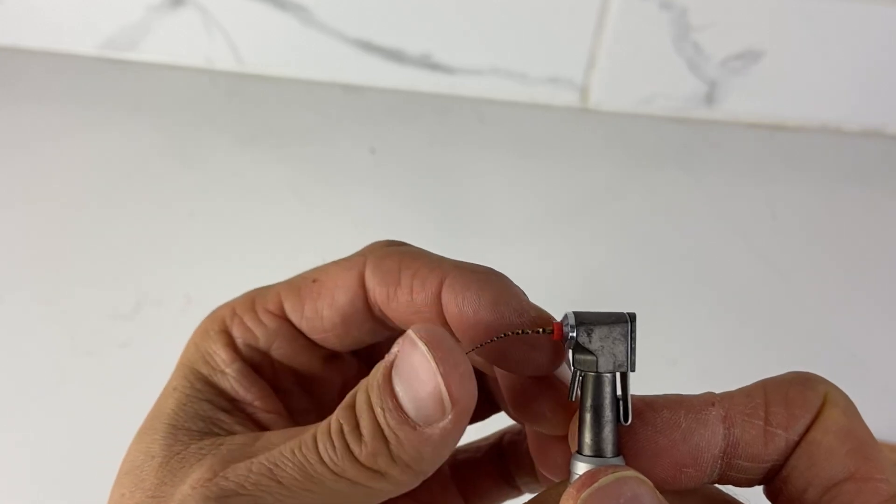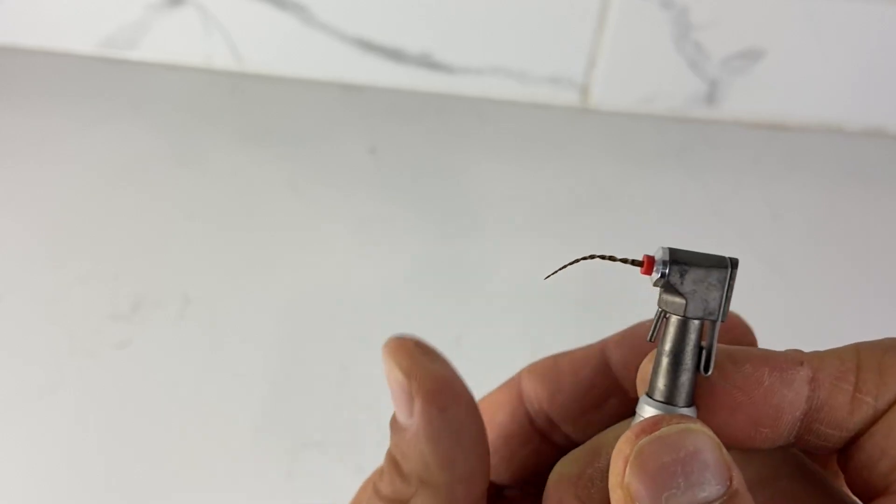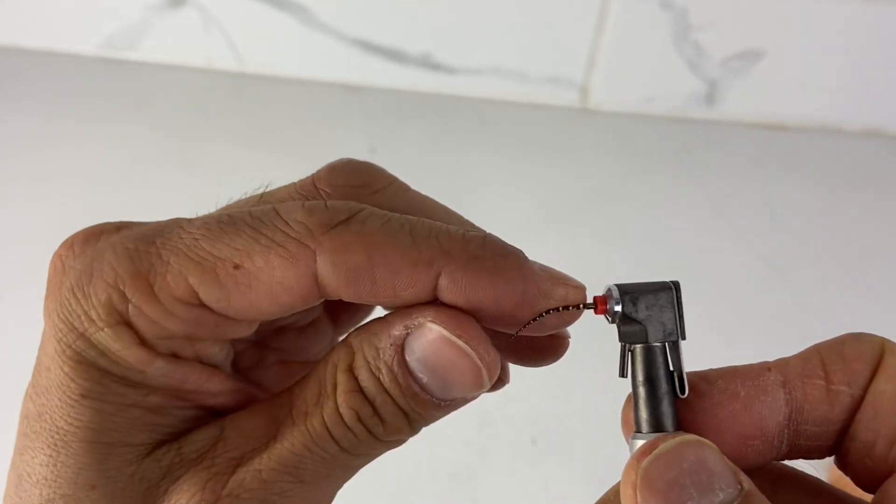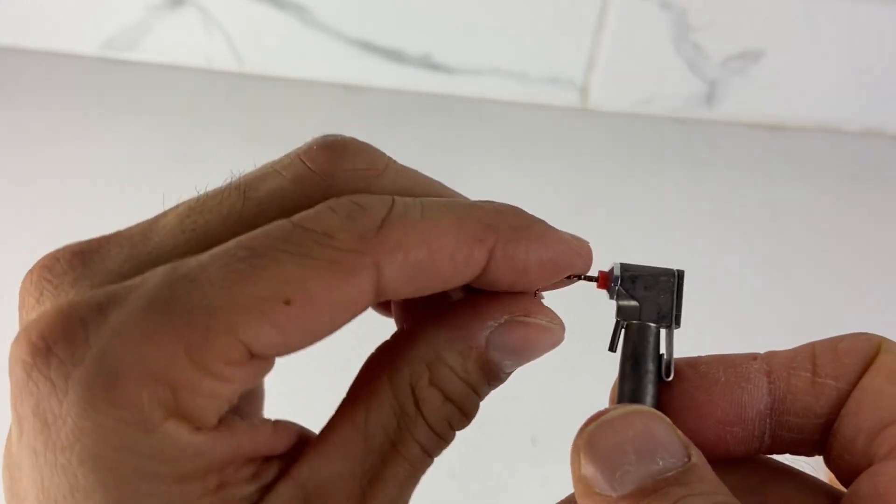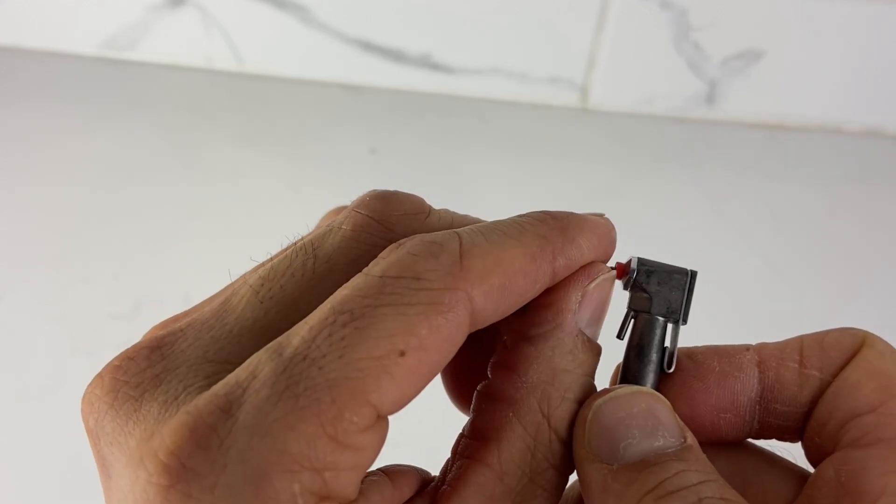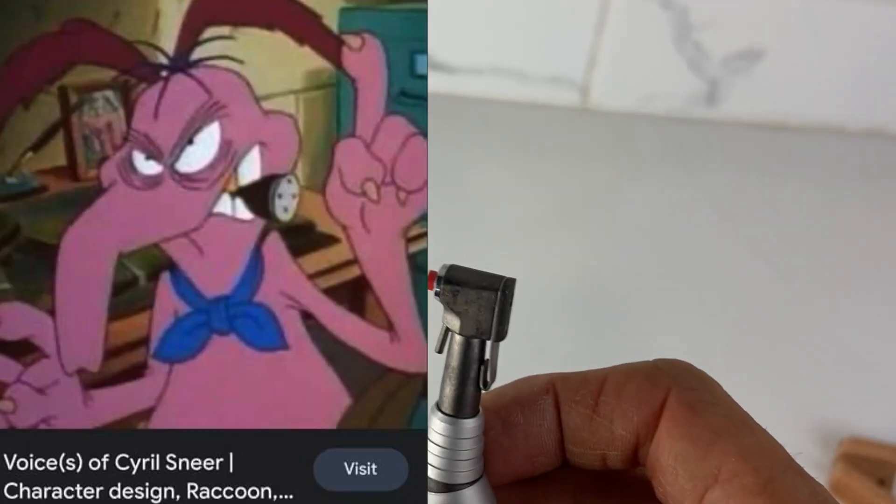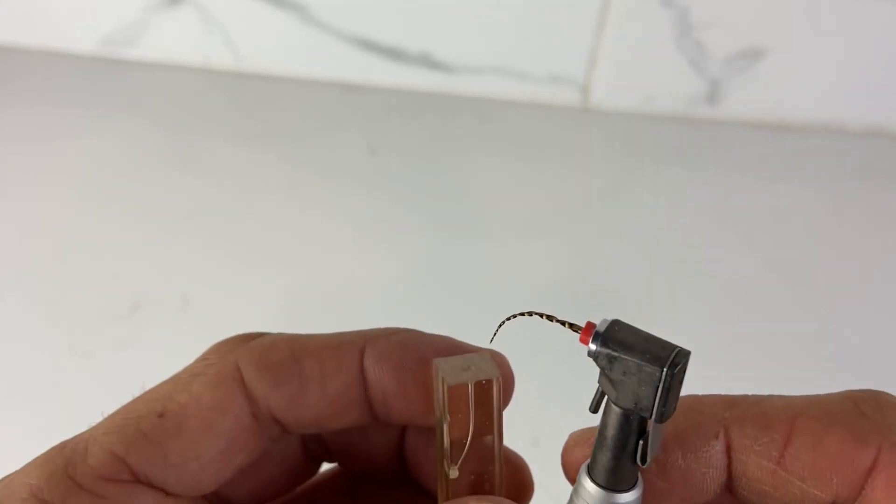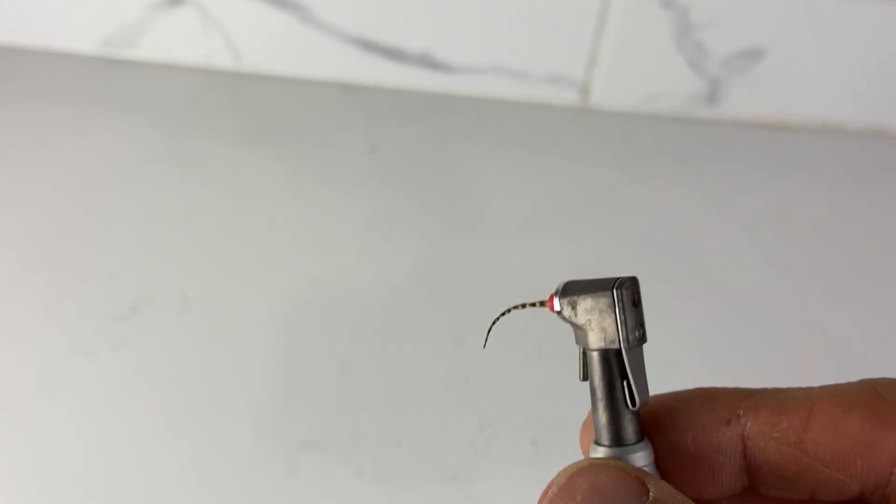And I'll actually see how my thumb just went like that. And that hopefully will give it more of a curve. And my experience has been that you're pretty much safe, especially if this is a brand new file. So there you go. That's, if you've ever watched the Raccoons, it's a Canadian cartoon show when I was a kid like 300 years ago, that's Cyril Sneer's nose. So that's another way. And I actually will use that.